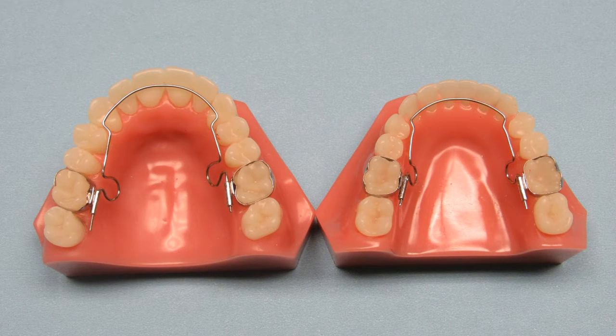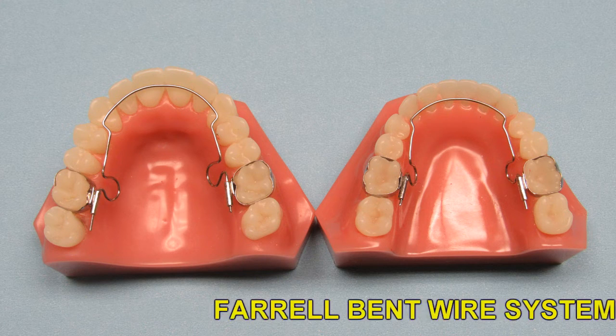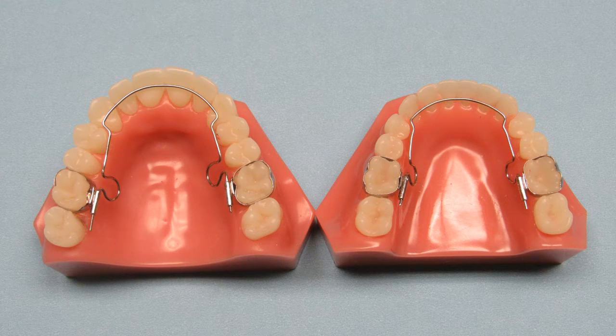The Ferral Bent Wire System, or BWS, can be used on the upper arch or lower arch or both to help flare anteriors forward, open up space for blocked out cuspids, align anterior teeth, and create space to un-crowd the anterior teeth.